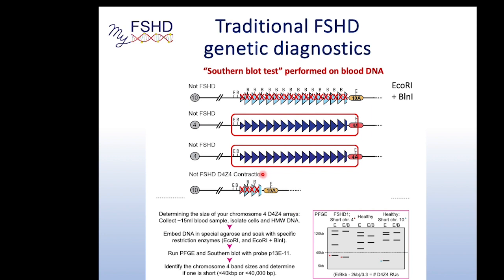Okay, because that recombination, if it's missed, think about it, the probe is here, right? The probe is going to be up here, and it only goes to the first cut. So unless the recombination was a complete recombination, that probe is not going to pick up, even if the fragments are not digested in that chromosome, in that hybrid. All right, so that's where the misdiagnosis comes in with the Southern blotting.